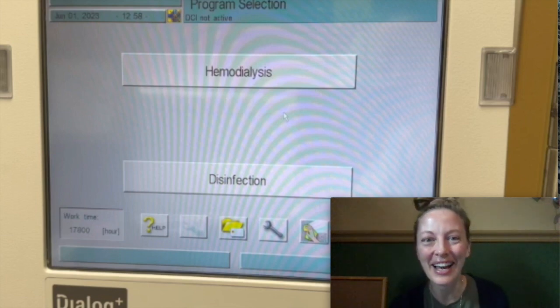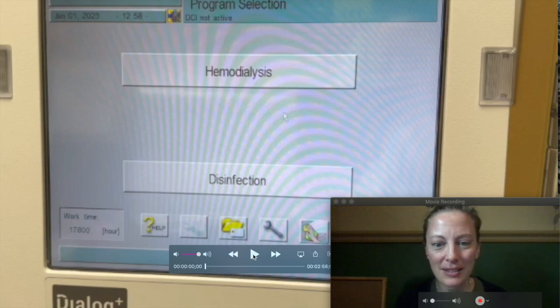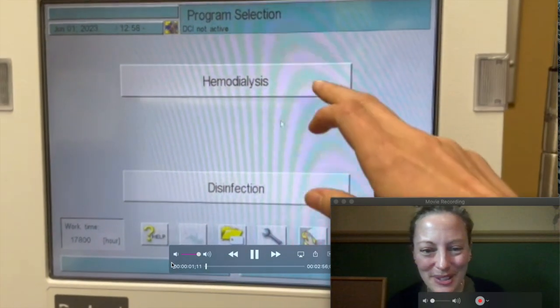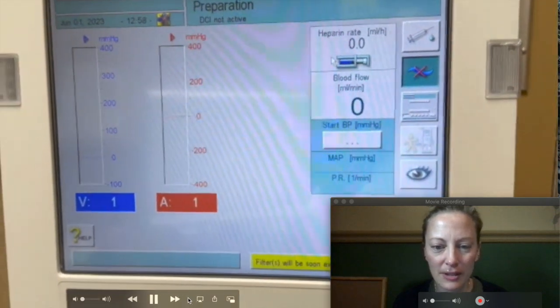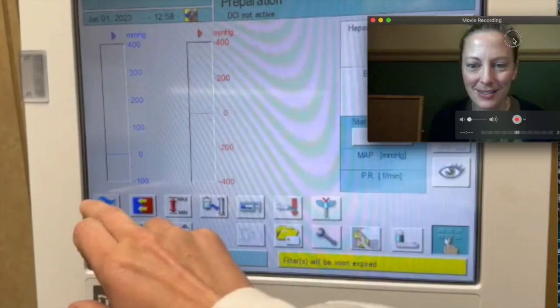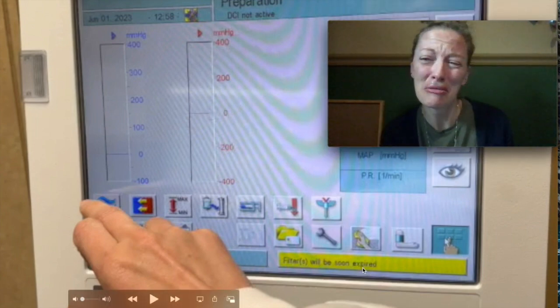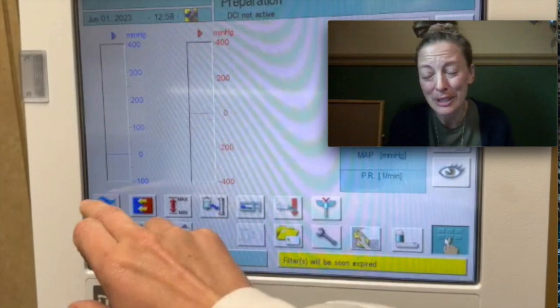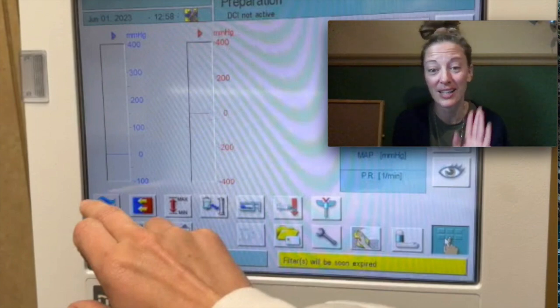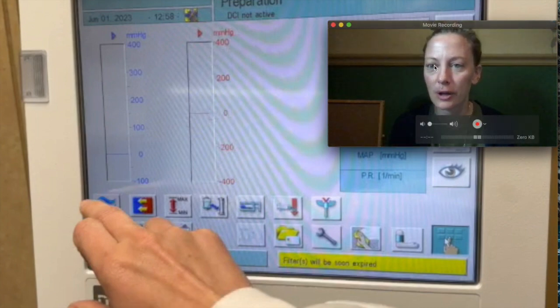This is a screen of a B-Braun dialysis machine. Up top here we can pick hemodialysis or we can pick disinfection. I'm going to choose hemodialysis. I'm going to pause every now and then. The first alarm that we're going to see is 'filter will soon be expired.' There is a filter on the back of the machine that needs to be changed about every 200 treatments. You change it and then you disinfect it. But you do not have to worry about that alarm right now — just lucky that we get to see it.